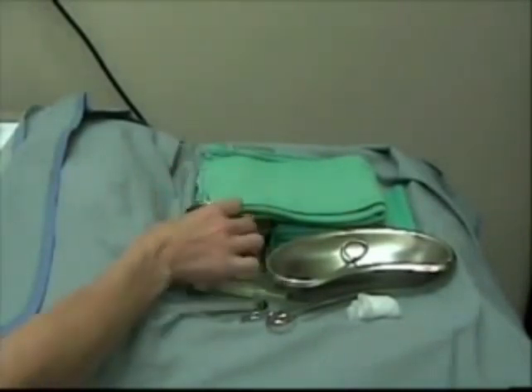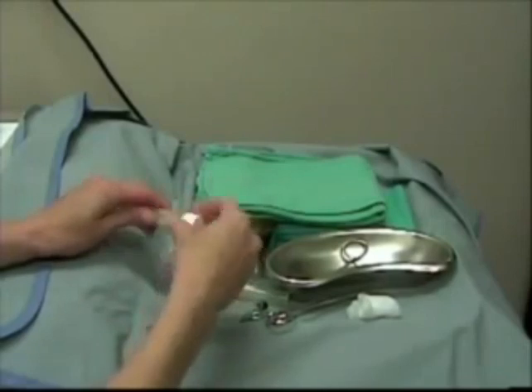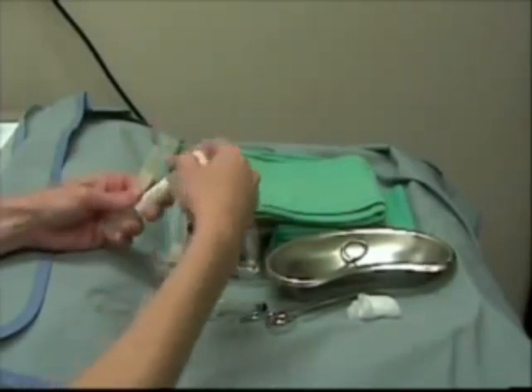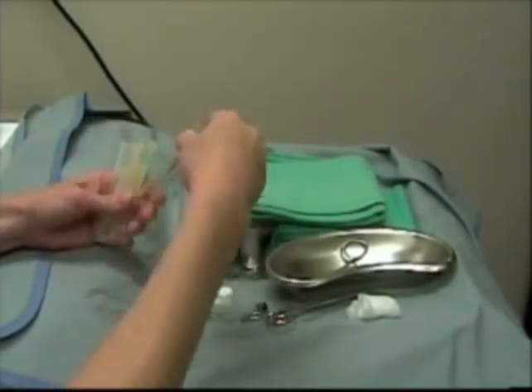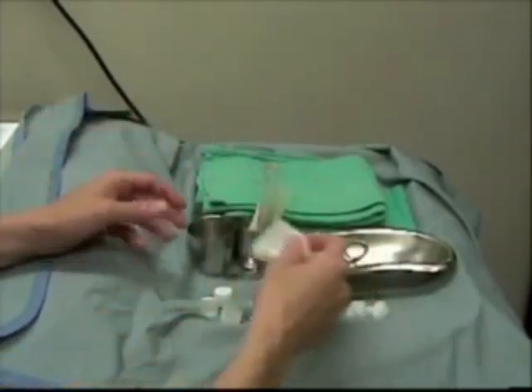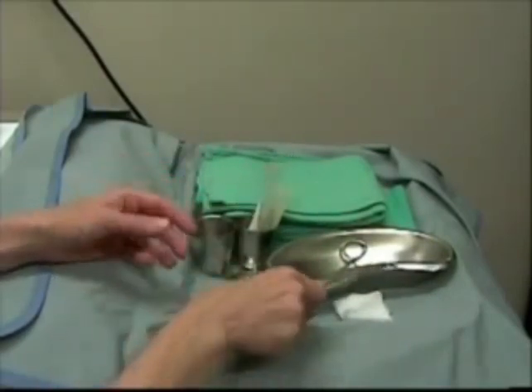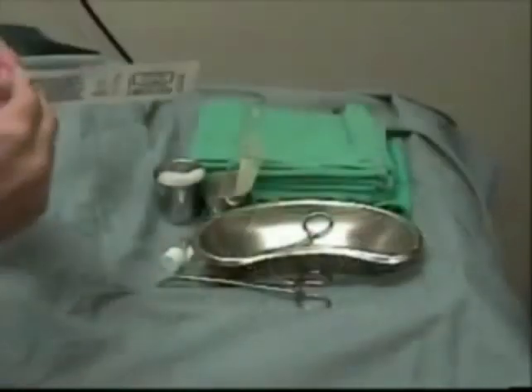Your equipment will come on a reusable or a disposable tray. Your tray will contain drapes, several containers, gauze, and a few basic instruments. Often it will have tubes. If not, tubes must be placed on your tray prior to beginning the procedure. Tubes should be opened before you begin to facilitate filling once you have successfully obtained CSF flow.